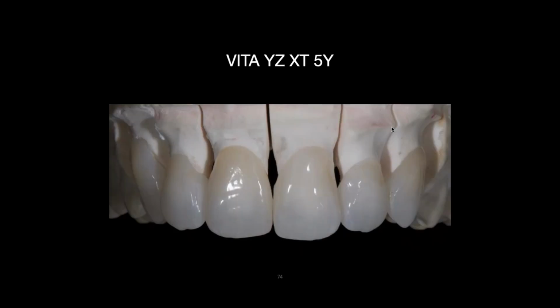So here you see the VITA XT, and I have like 0.5 millimeter of space. You can see the preps underneath this white die stone. And these are test ones. I have all of these in the lab. And so I fired them a little bit higher than what it called for, and I got this beautiful look. And I can stain them and do whatever.